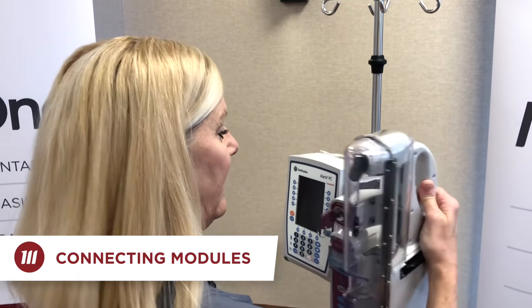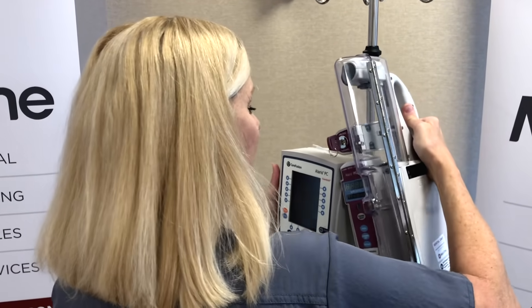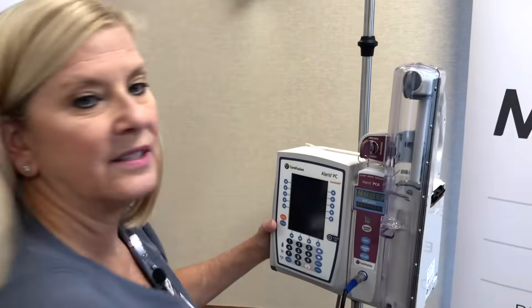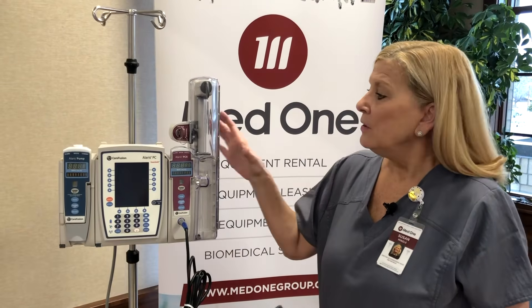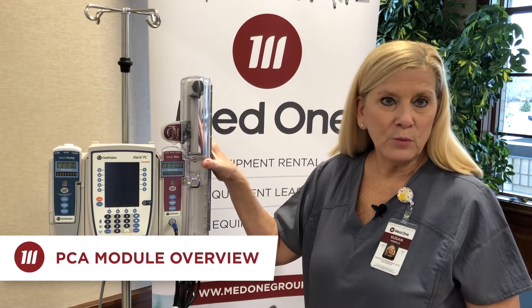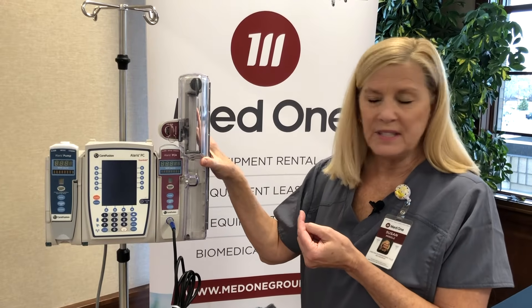Hold the PCA by the handle, raise it to a 45 degree angle, insert it into the IUI connector, and then click it into place. You should hear the click, knowing that you've got connectivity established. The PCA module was placed on the right-hand side of the PCU — we'll talk about that in just a second.